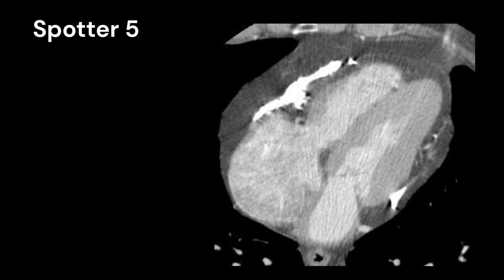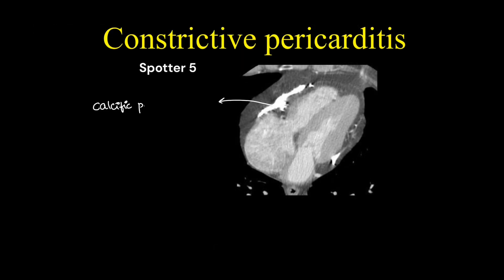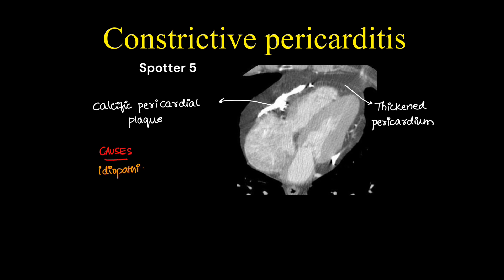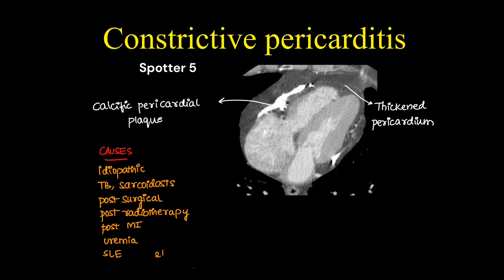This was a case of constrictive pericarditis. We can see calcific pericardial plaques and a thickened pericardium. Causes of this condition include, most commonly, idiopathic infections such as TB, sarcoidosis, post-surgical, post-radiotherapy, post-myocardial infarction known as Dressler syndrome, uremia, and SLE.